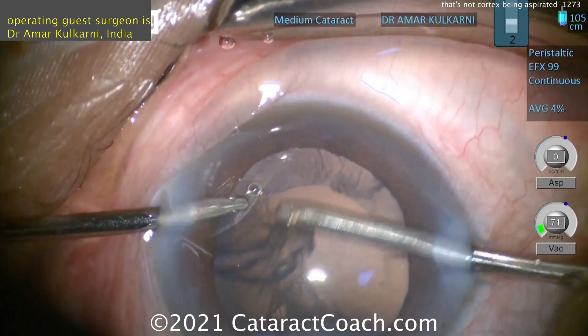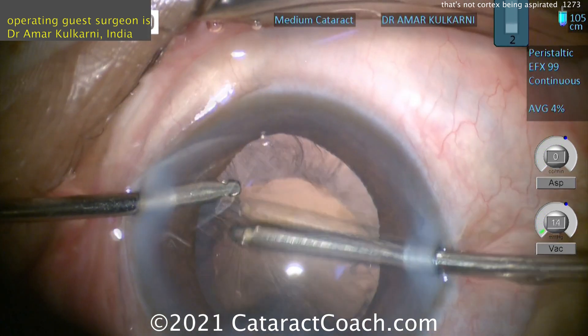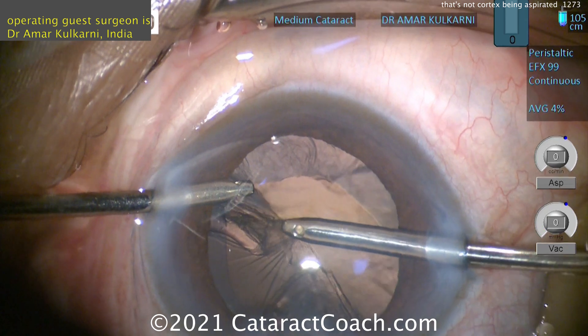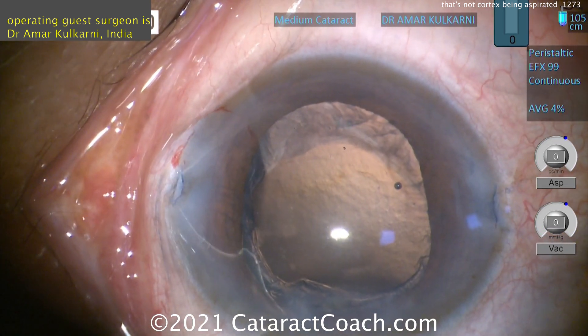Let me show you the cleanup of the cortex — that looks okay. And then trying to get more of the cortex, watch carefully. Those linear lines — that's zonular dialysis right there. That's the capsule being pulled. So you don't want to do that. You can re-inflate it with viscoelastic here.